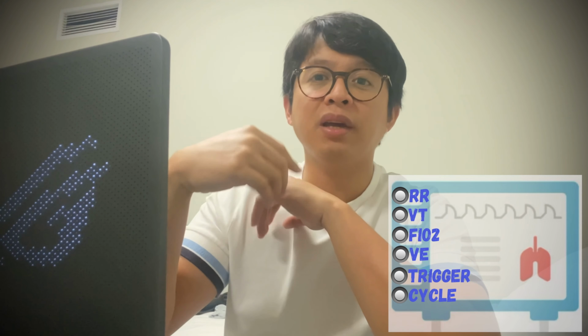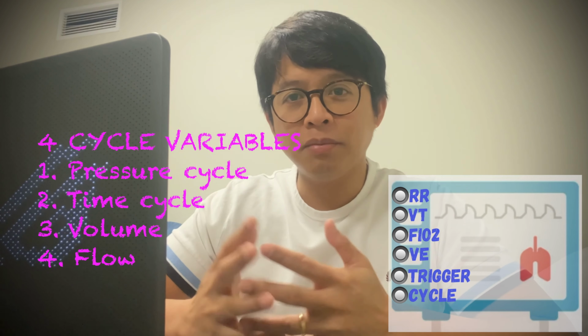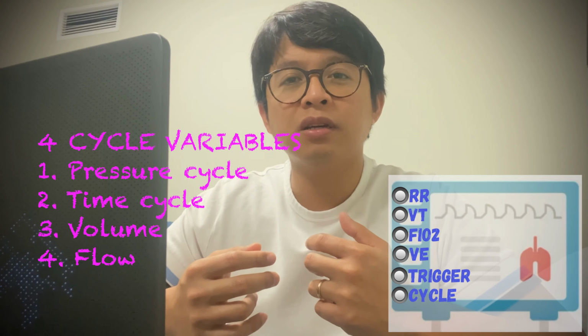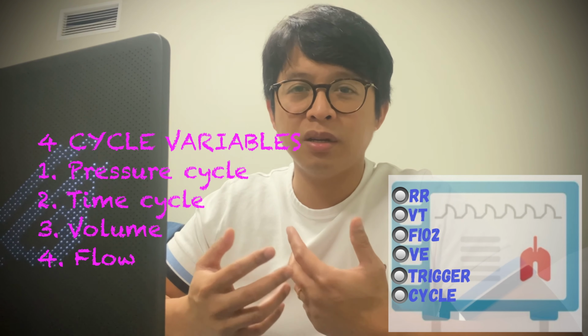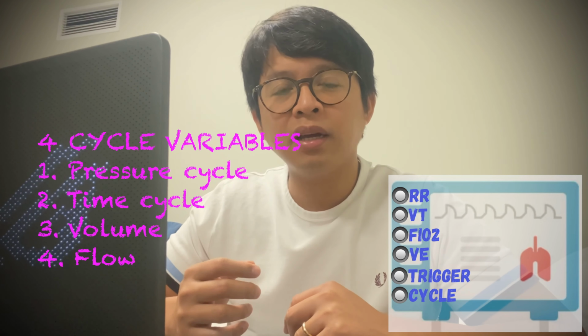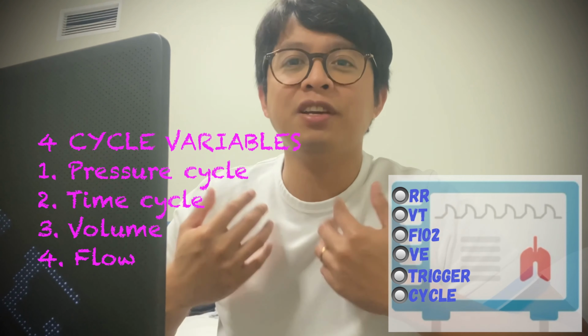Four variables are used to determine when to cycle to exhalation. These are the pressure, time, volume, and flow. For example, the most common application for pressure cycling is for alarm settings. If the patient becomes extremely asynchronous, or the patient is coughing, the high pressure alarm will be triggered and the inspiratory phase ends, resulting in exhalation.